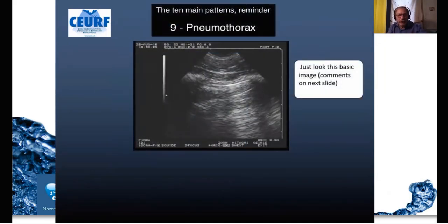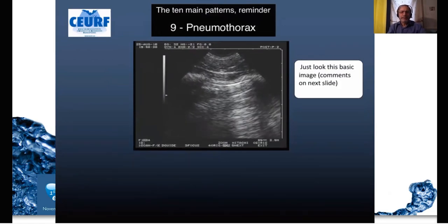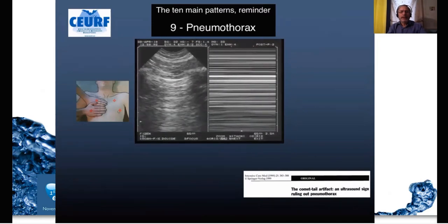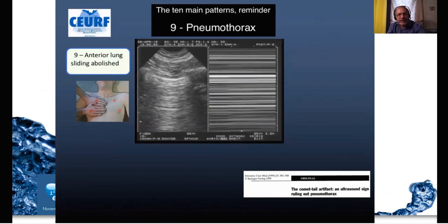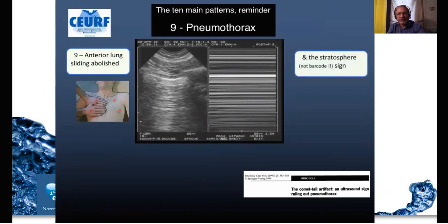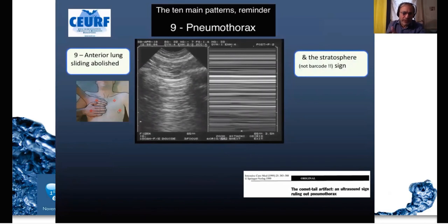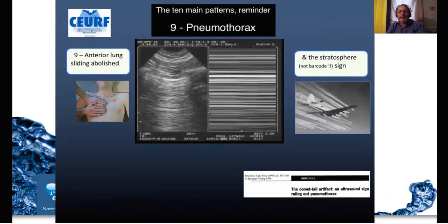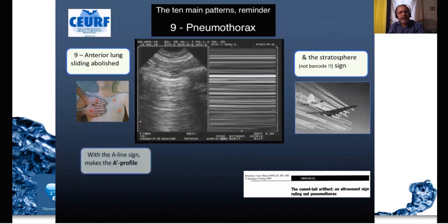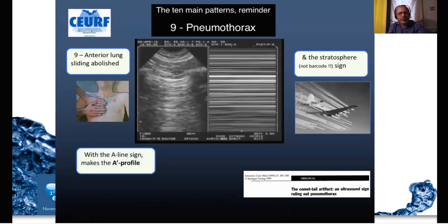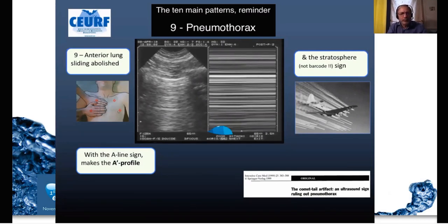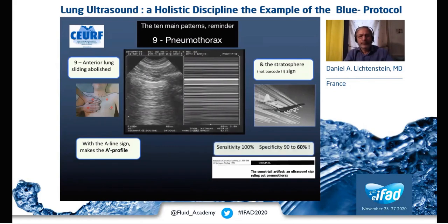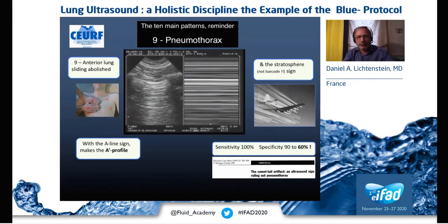Pneumothorax — this is the raw image. In this slide we see that at the left anterior lung, sliding is abolished, which generates the stratosphere sign — also known as the barcode sign. That indicates stratospheric phenomena. We have the repetition of the pleural line — the A-line — and this is the A-prime profile of the BLUE protocol.